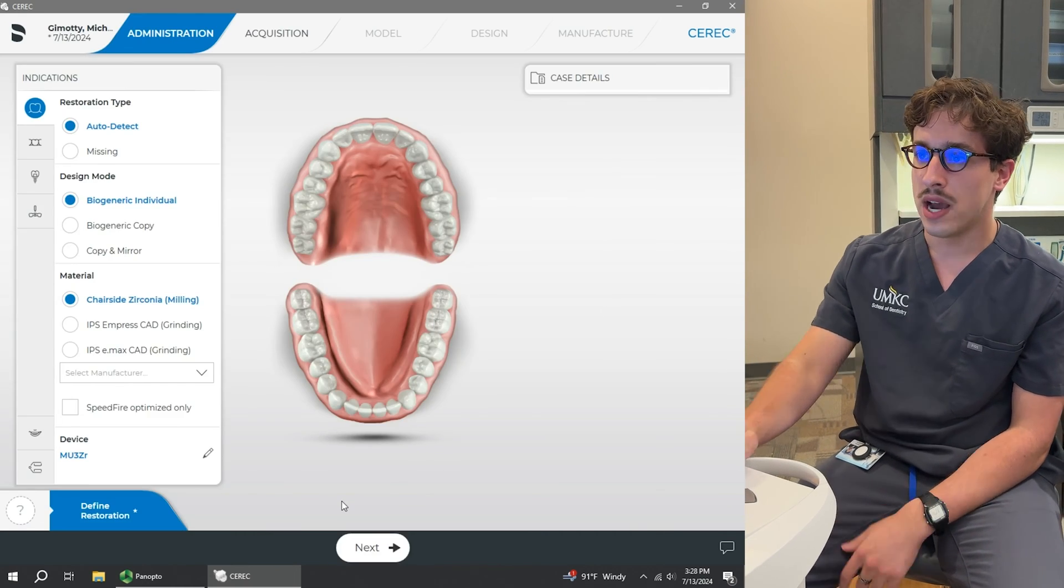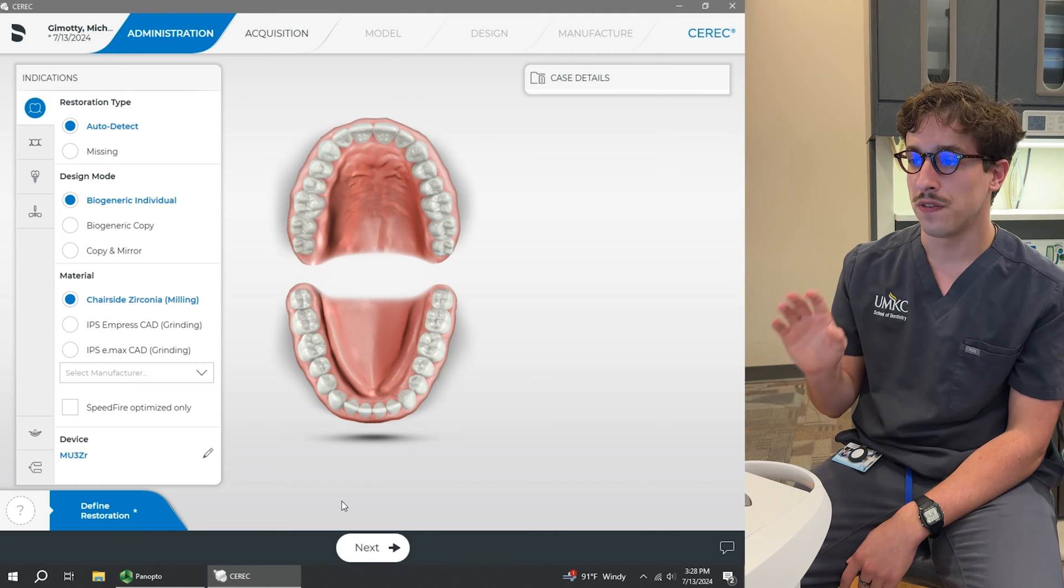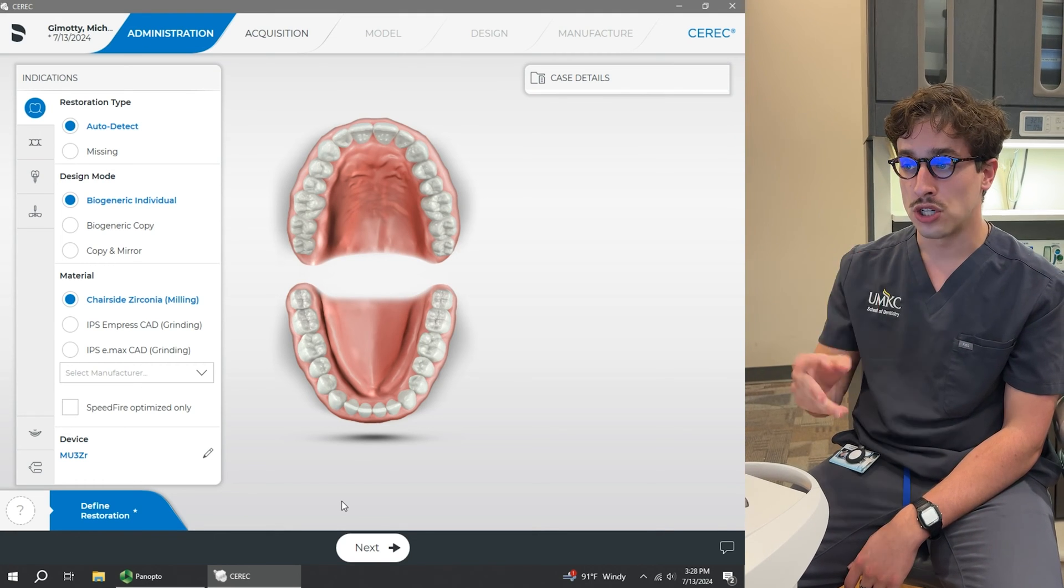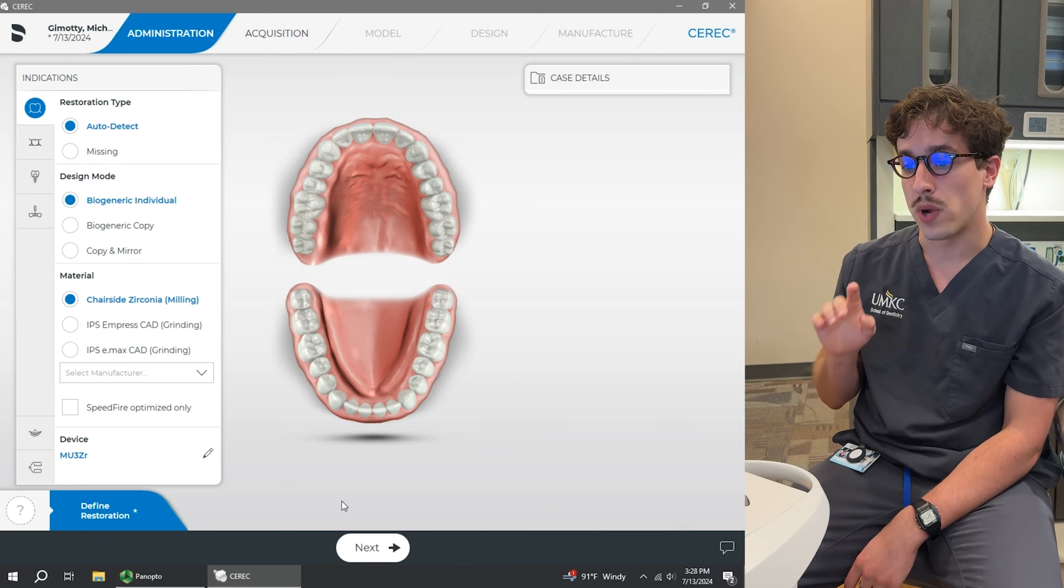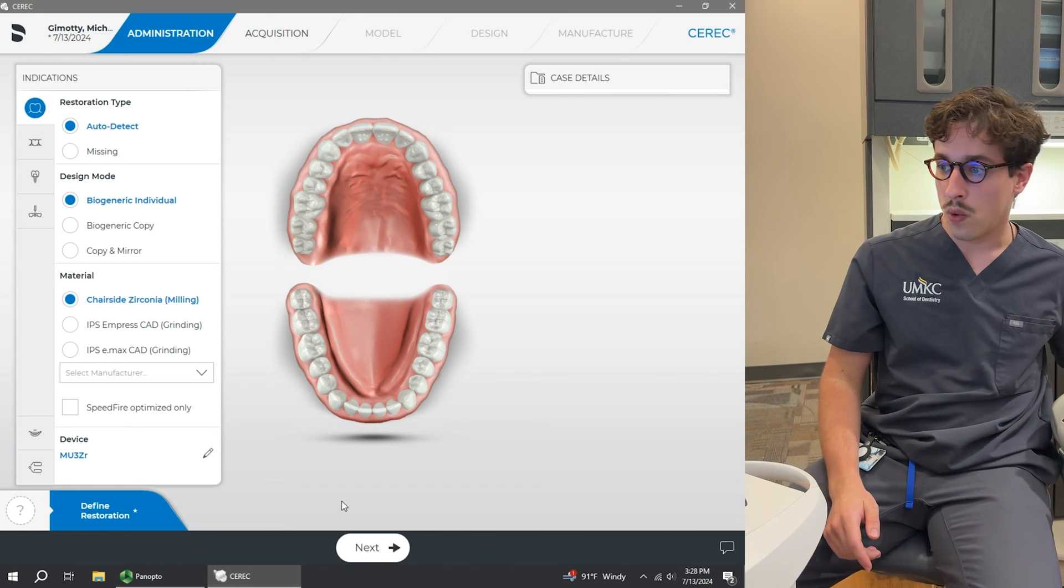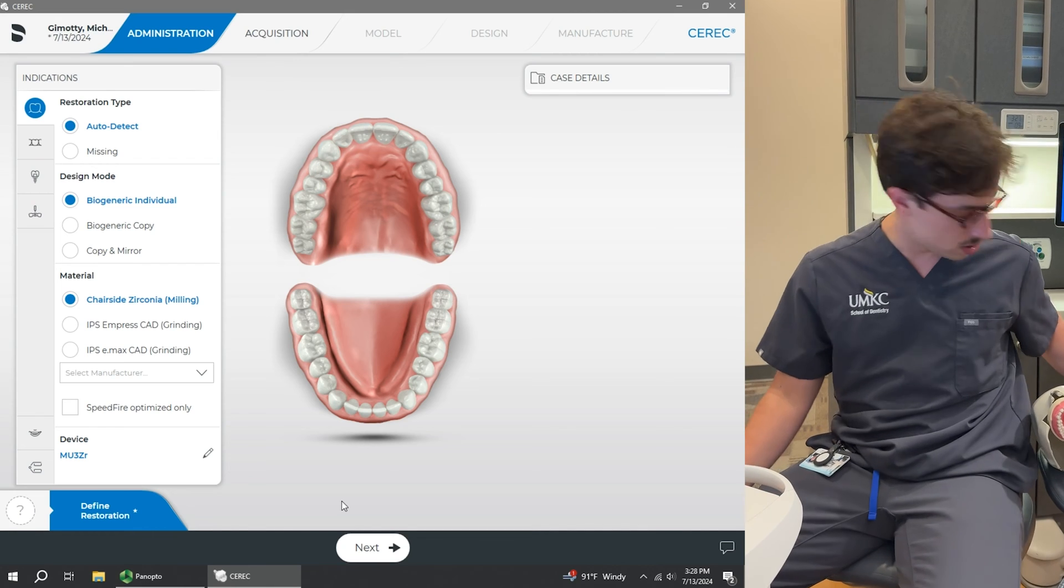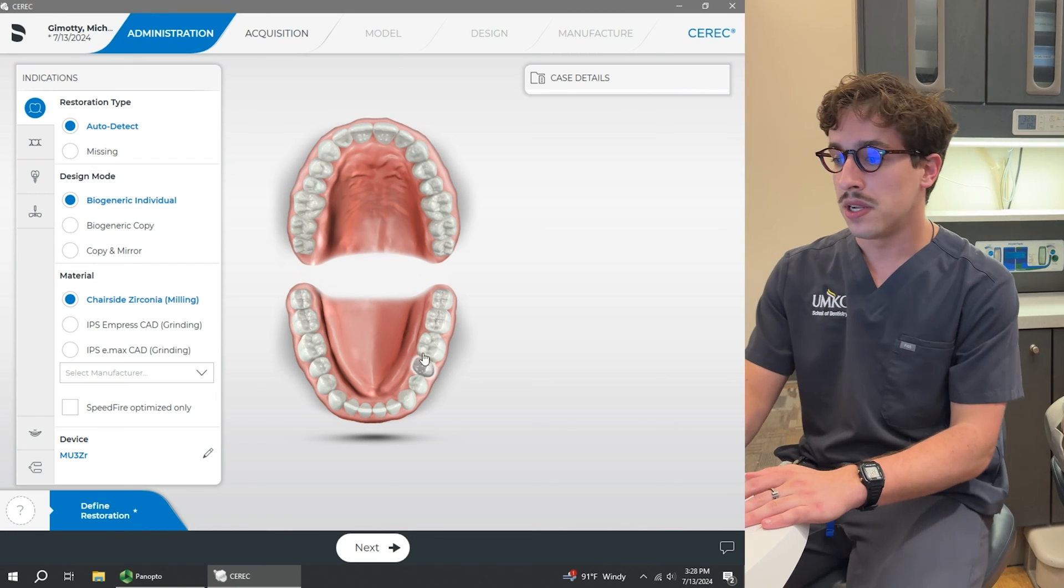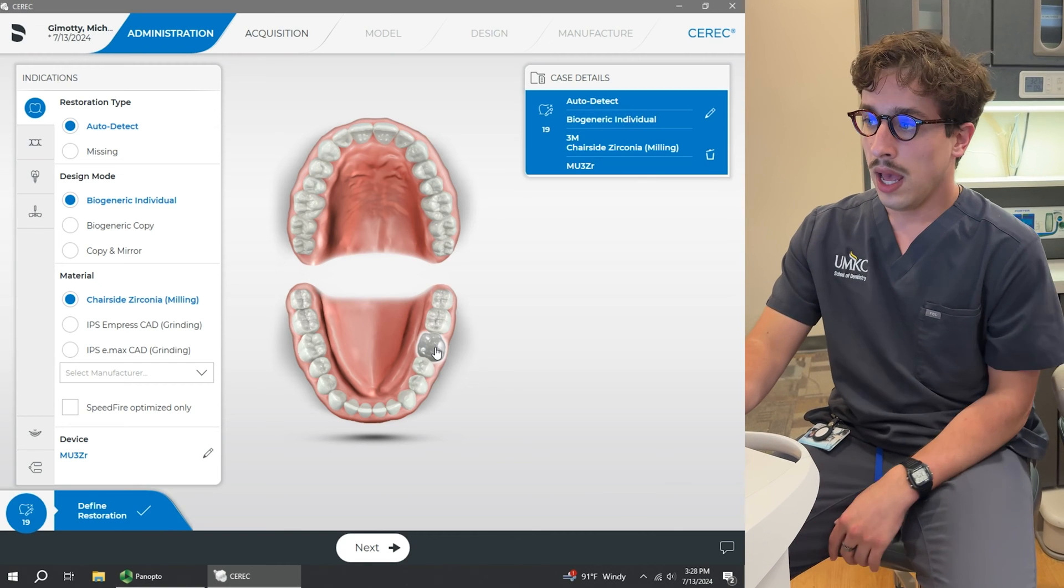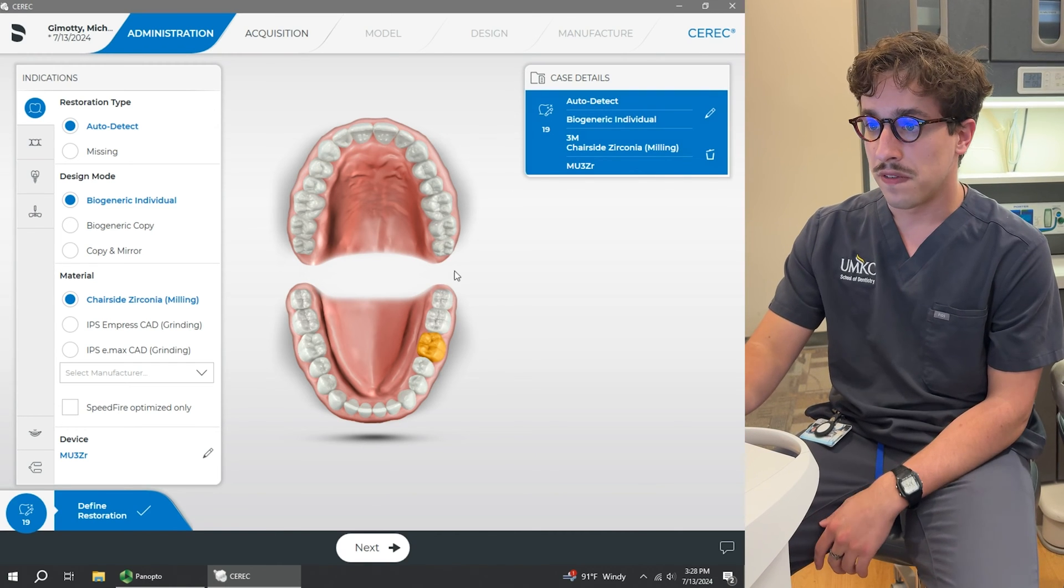So now the Administration tab pops up. So there's a few things that we need to select. First off, we need to make sure that we select the correct tooth. So in this case right here, we've got tooth number 19. So I'm going to select tooth number 19 right here. And then this will pop up a bunch of different options.